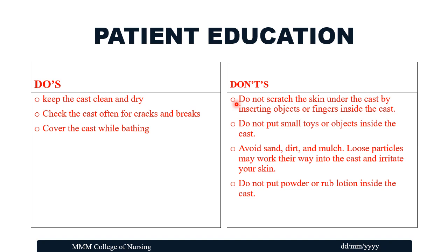What a patient should not do. Don't scratch the skin under the cast by inserting objects or fingers inside the cast. If it is itching, you should educate the patient not to scratch it with any objects. Don't insert any objects or finger inside the cast to scratch the itchy skin.